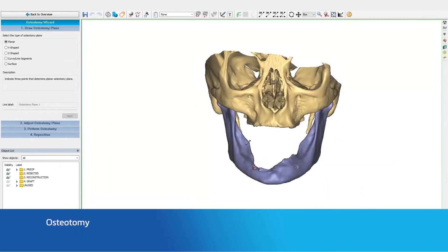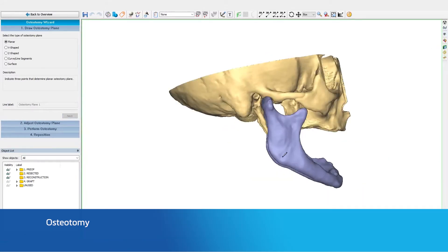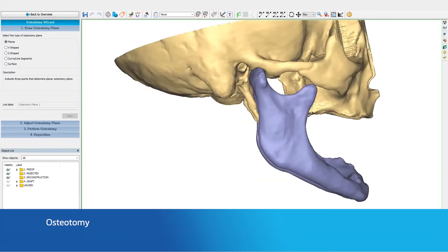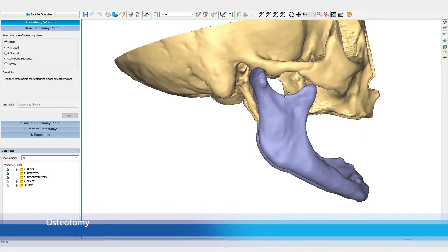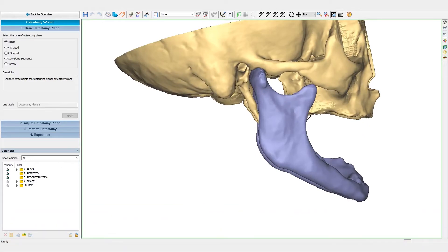The first step is indicating the osteotomy planes. By indicating points on the mandible, we can plan the resection of the tumor. Various options are available to indicate osteotomies that are curved or have a step.